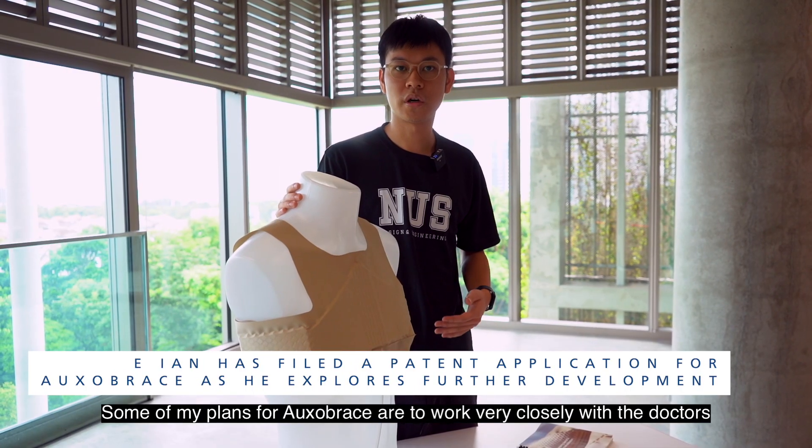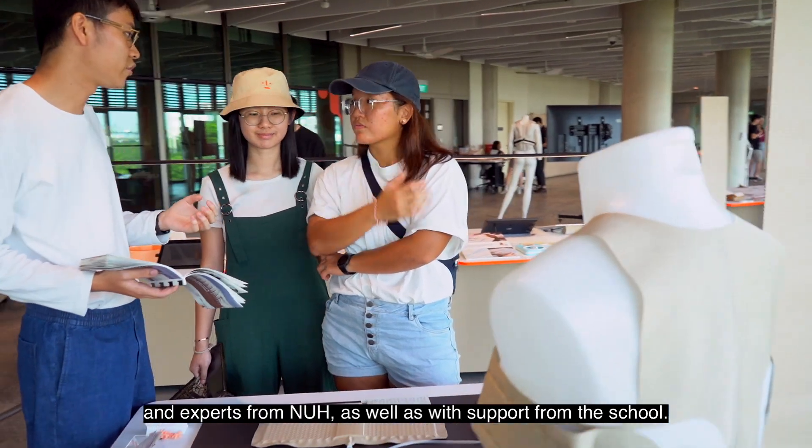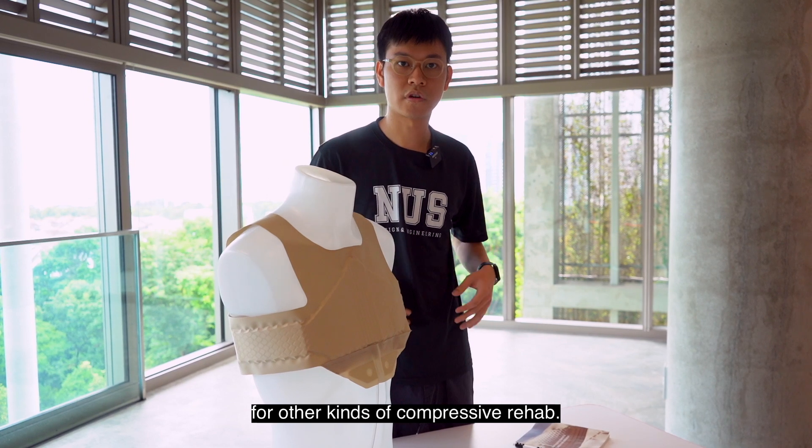Some of my plans for Auxobrace are to work very closely with doctors and experts from NUH, as well as with the support from the school, and to further develop this structure going beyond sternum rehabilitation to see where it can be applied for other kinds of compressive rehab.